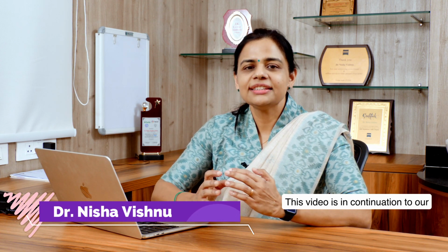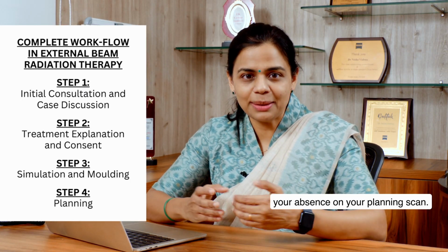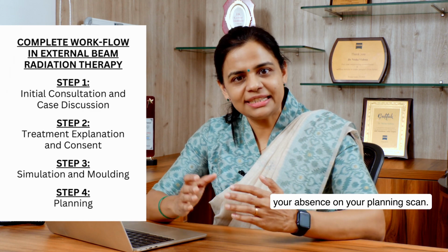This video is in continuation to our last video, where I was discussing the workflow of radiotherapy. If you have not seen, please go back to part 1 and understand, and please come back. So, now that you understand what is simulation, let us understand the next step, that is planning, mostly done by your treating team in your absence on your planning scan.